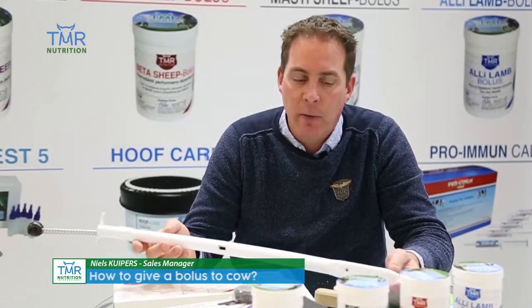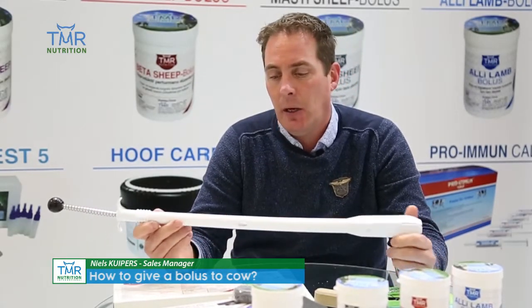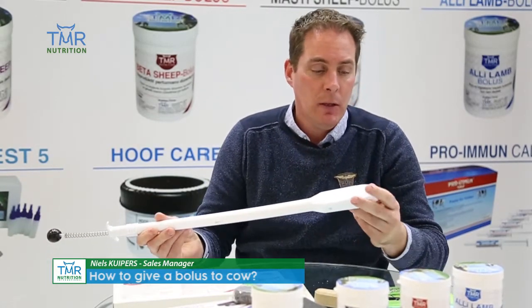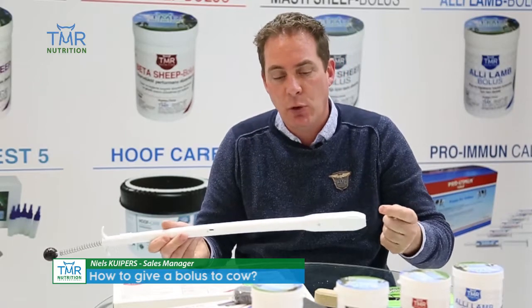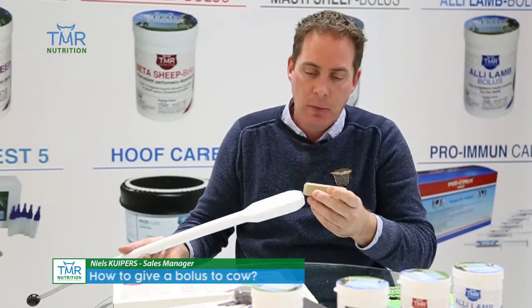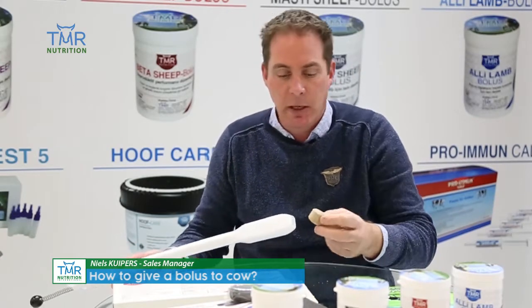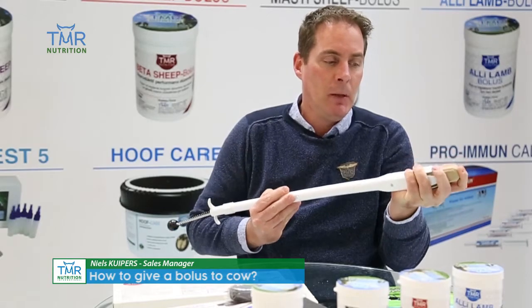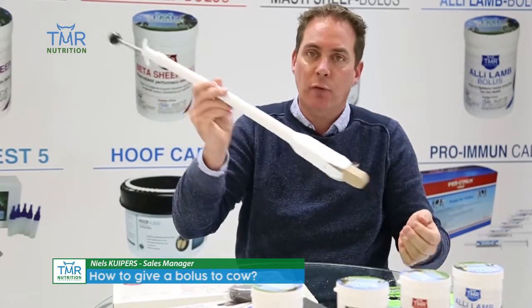Using boluses is very easy, and this is a well-designed applicator with a nice edge so there will be no damage. You just take the bolus out of the package — it's mostly packed in plastic — and put it into the applicator like this. It doesn't fall out, so it's perfect.